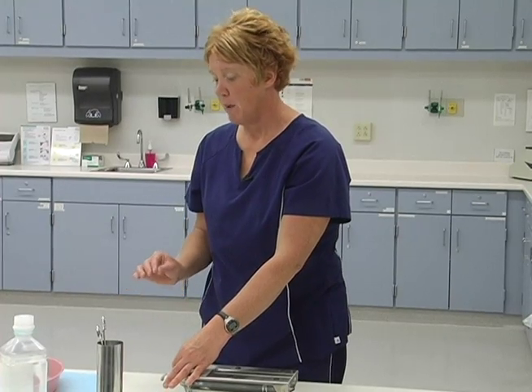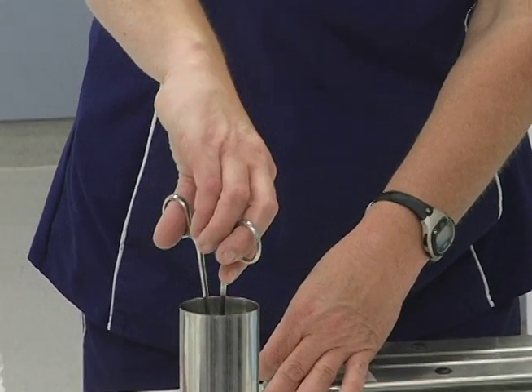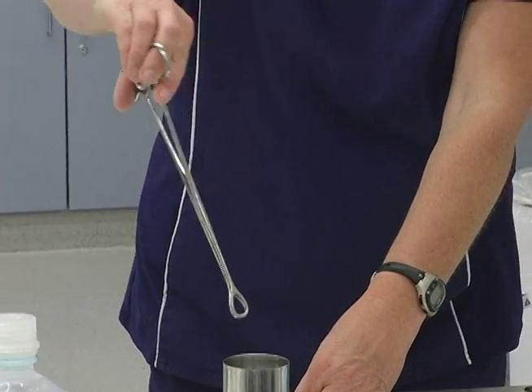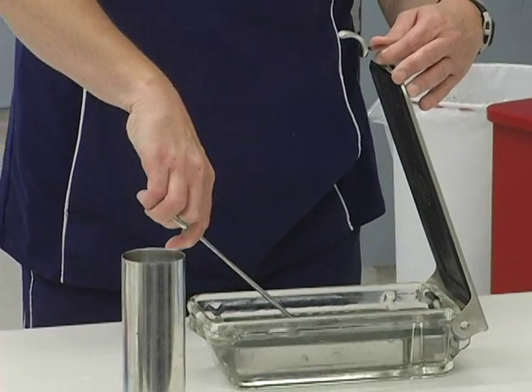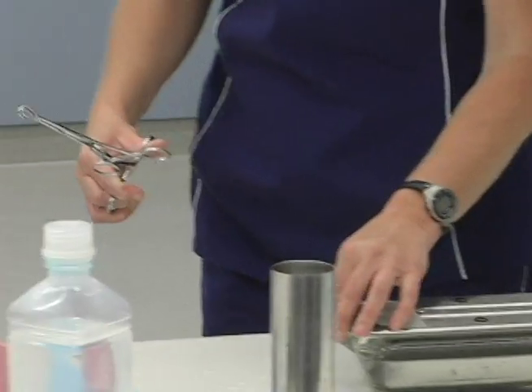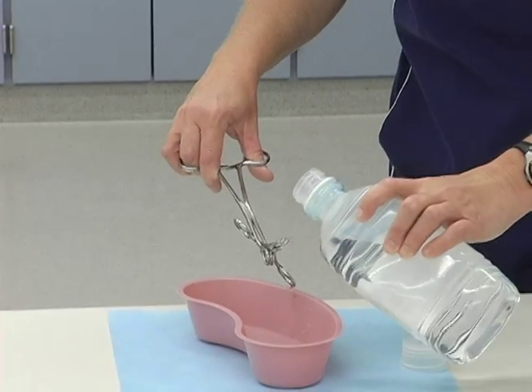When you do transfer your instrument over to the sterile field, make sure that when you come up and out of the transfer area, you do not touch the sides. Make sure we rinse.